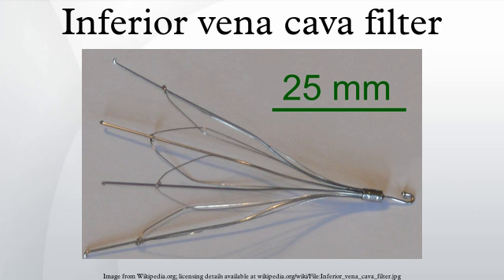IVC filter composition, MRI dangers and effects. While most IVC filters are made of non-ferromagnetic materials, there are a few types that are weakly ferromagnetic. Accordingly, IVC filters fall under the MRI safe and MRI conditional categories depending mostly on type of material used during construction.